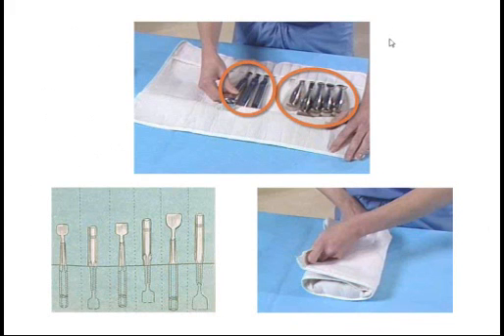The top picture demonstrates the heavy chisels being placed into the absorbent pouch with all heavy handles facing one way. The picture on the left indicates that the metal mass is more evenly distributed, showing the proper way to organize, position, and fold heavy-handled instruments for sterilization. The instrument cloth pouches should be folded into thirds, not rolled. When rolled, the metal mass is not evenly distributed.